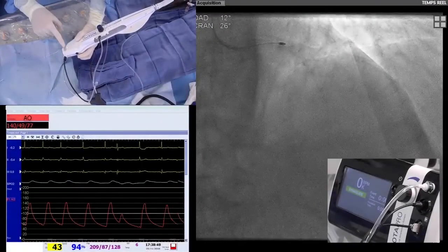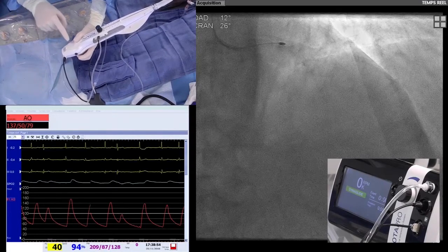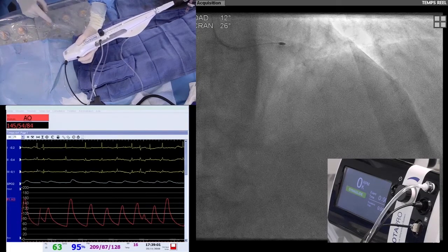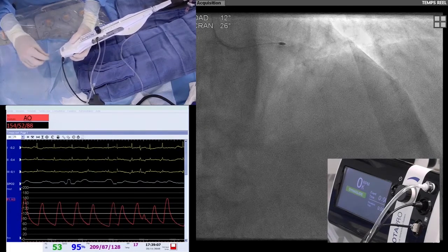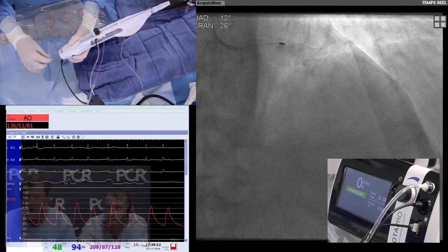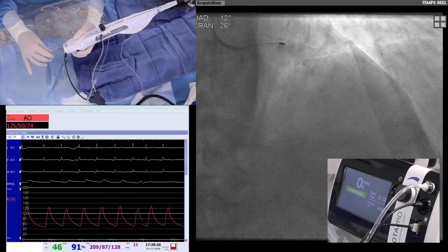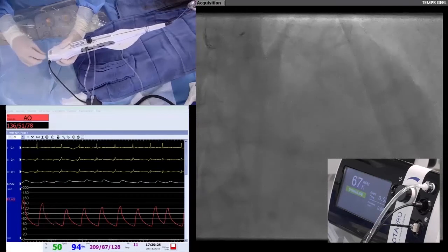I push on the Dyna, and you can see the green light in this part. And then I have to start by pushing this button, not the previous one. Is it clear? It is. Interestingly, if you don't press the button and you press the Dynaglide operator, it won't work. So there's a safety mechanism in there to prevent that from happening. Correct. And then I can push the wire and pull back the burr, like we do with an over-the-wire balloon, actually. You can hear the.